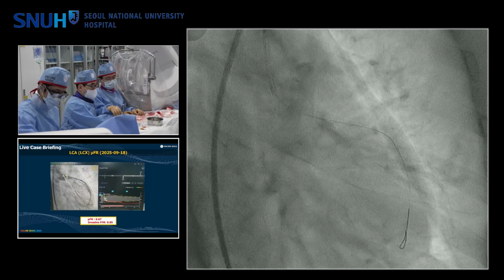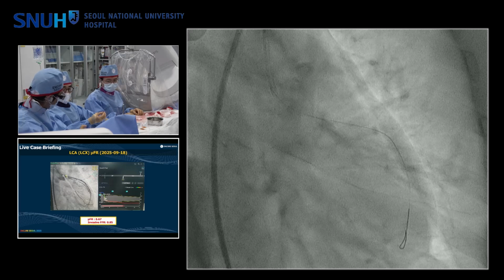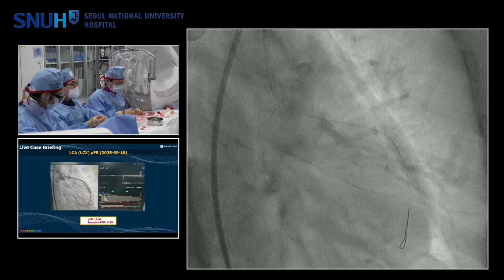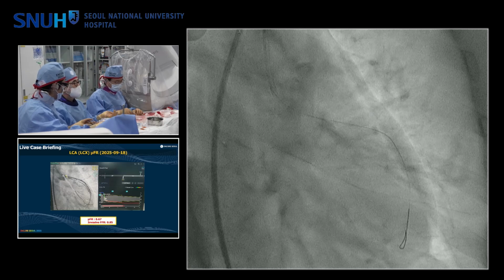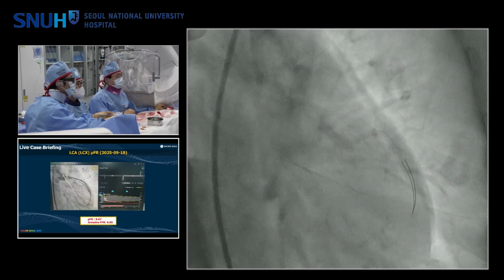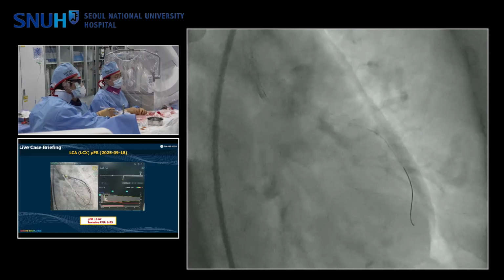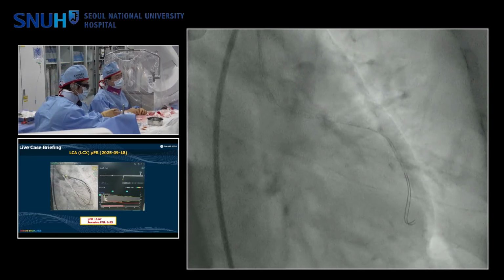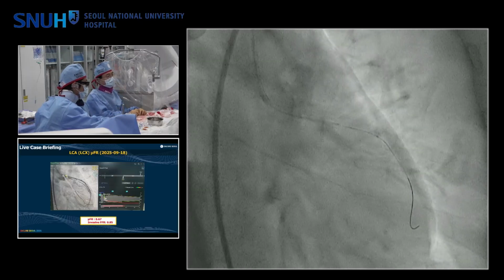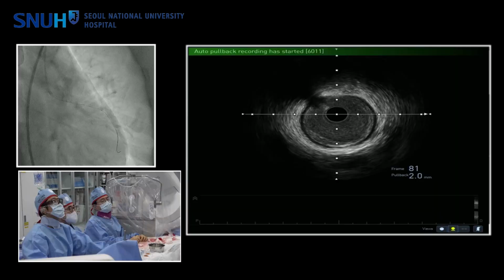아까 데이터가 나와 있으면 한번 비교해 보죠. 얼마나 좋아졌는지. 네. 아, 알겠어. 너무 나왔다. 안 들어가겠다. Okay. 오케이. 저 IVUS로 트랜스미션 화면 전환. 오케이.